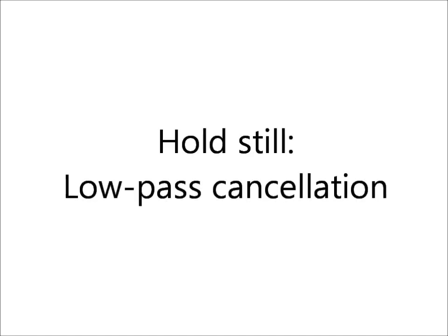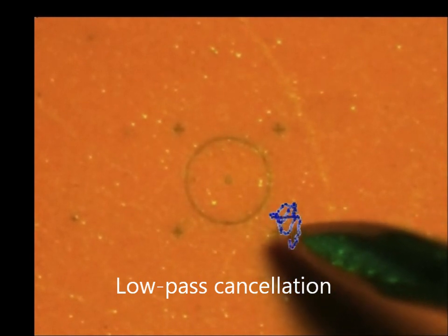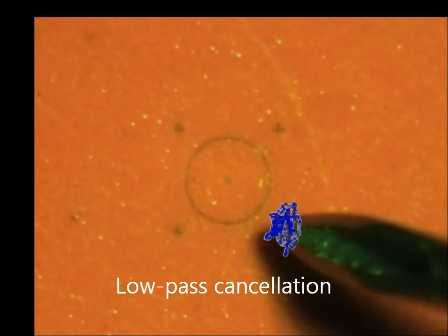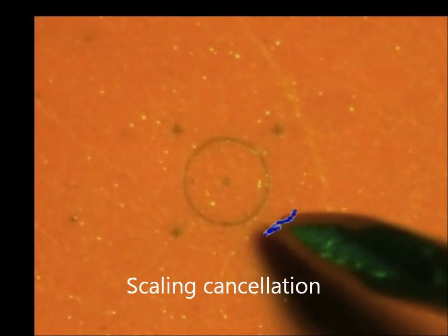Low-pass cancellation removes most of the rapid shaking but still leaves a considerable amount of slower wandering motion. Further reduction of the low-pass cutoff would destabilize eye-hand feedback. The scaling algorithm further reduces tremor by reducing the tip motion to one-third of the hand motion, attenuating even low-frequency involuntary hand motion.